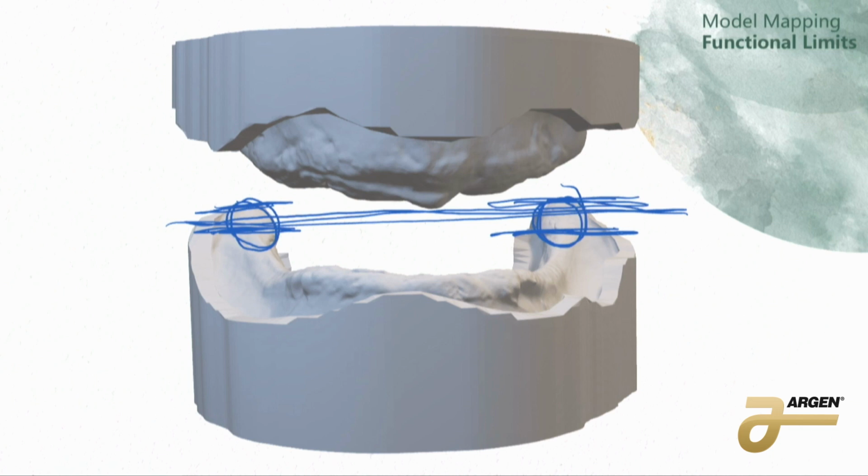So even if you have a really good dentist that gives you good records, sometimes maybe they don't notice, because they're seeing it in the mouth. They're seeing it from the face. They're not seeing it from a model like we are, right? So it's okay to talk to them and tell them, I've set it to where you want it, but it's outside of functional limits. Can we make some changes? Try it in. Can we see what we can do to get that back inside?